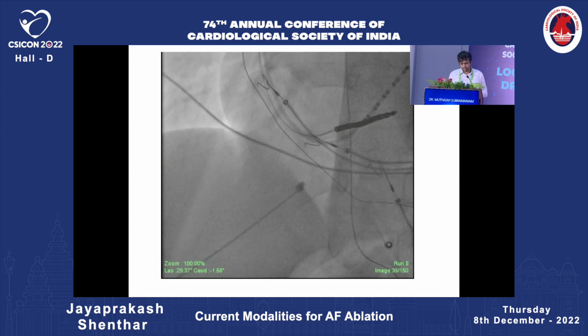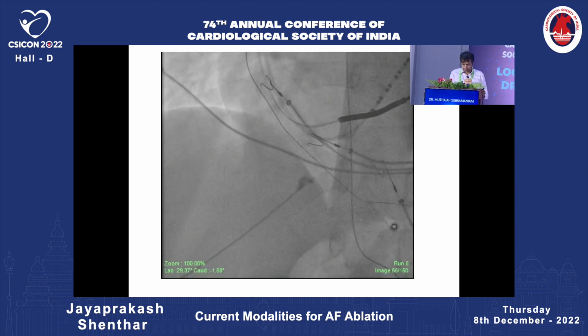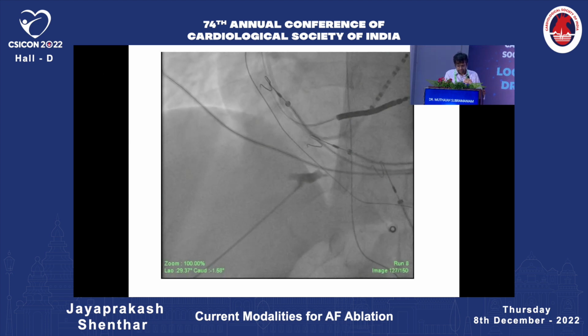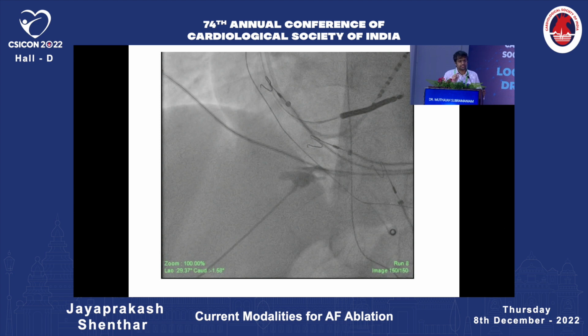So this is how you're entering the epicardial space. Initially the best thing is to use a little bit of dye. As soon as you enter the epicardial space here, what you just saw is you will feel some pulsations. It's always important to use your Tuohy needle as a slightly up-facing needle. You want to keep your needle tip away from the RV surface. So if you're going anteriorly, you want the Tuohy needle to face towards you and inferiorly away from you. And as soon as you feel the pulsation, 1 or 2 mm from there, you will enter the pericardium.